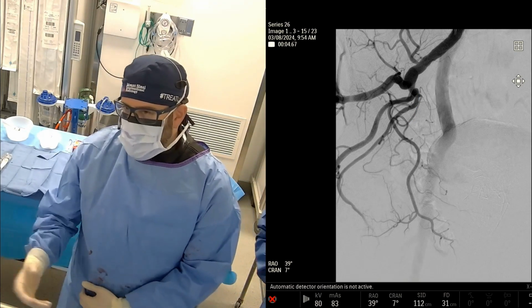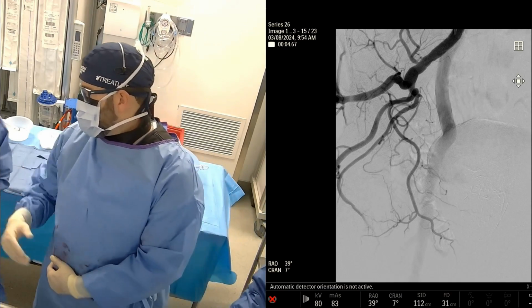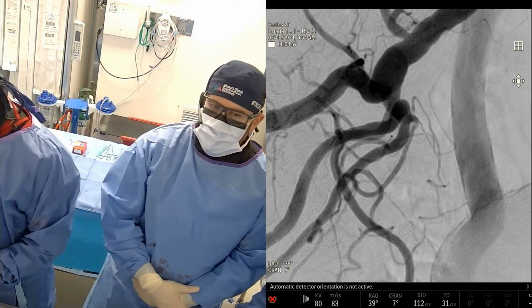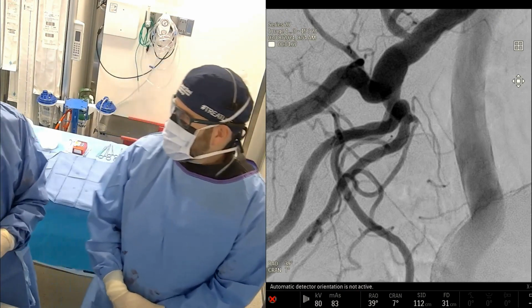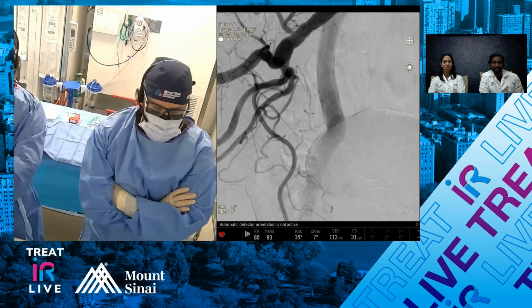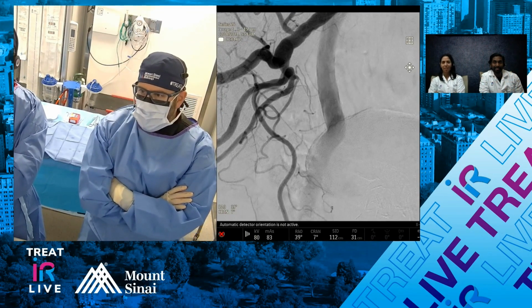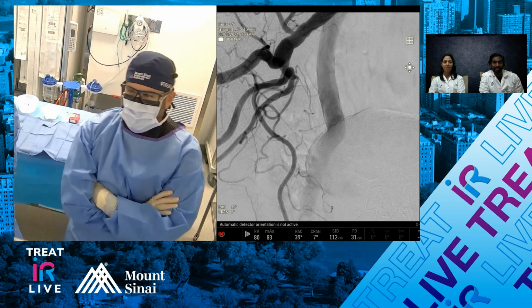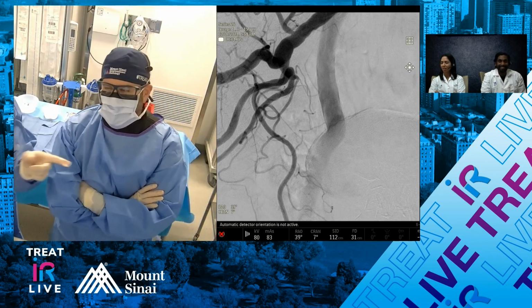It's most common, again, percentage-wise. For Aaron's case, we'll get into it. 30%, I believe, the most recent data are going to be the type 1. We actually looked at this. Well, they're about equal, it depends on what you look at. A type 4 is probably the most common. I'm in Dan's camp. Can we roadmap that?